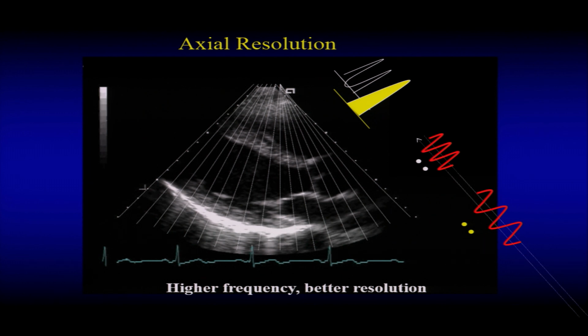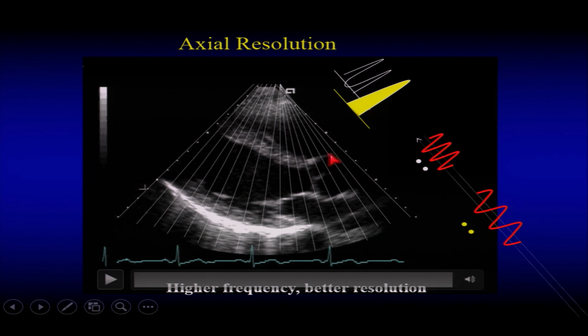Two important principles. There are a few principles that I'm going to highlight, for sonographers, cardiologists, whatever it is. There's axial resolution and there's lateral resolution. Axial resolution is much better for ultrasound. If you're in the lateral plane, the resolution is much less than axial. Axial resolution is related predominantly to the frequency of ultrasound. And the question is, in any resolution, can I distinguish two dots separately? How can I know that this dot here is separate from this dot here?